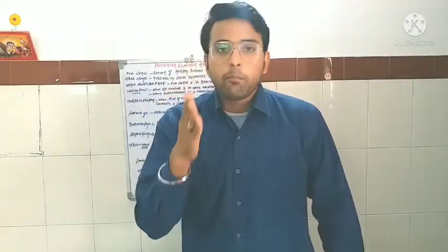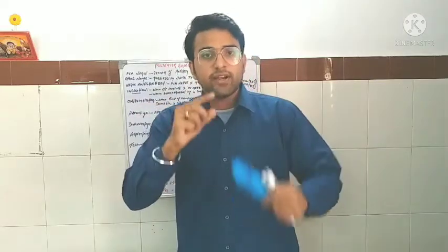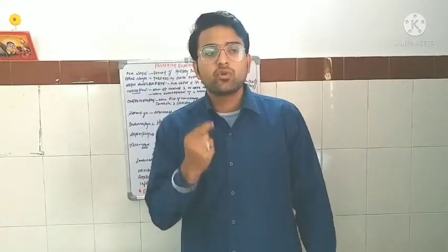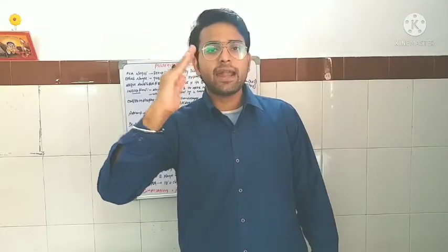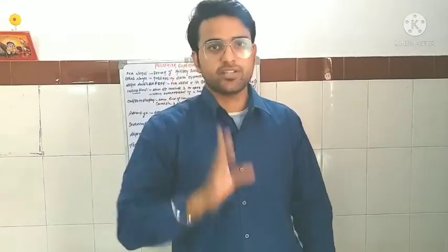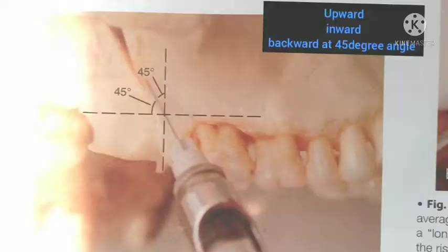The needle should be directed superiorly, posteriorly and inwardly, at an angle of 45 degrees. That is the first thing. Then you must know the boundaries.